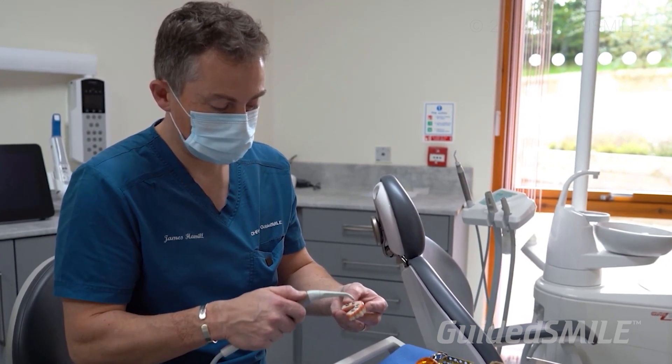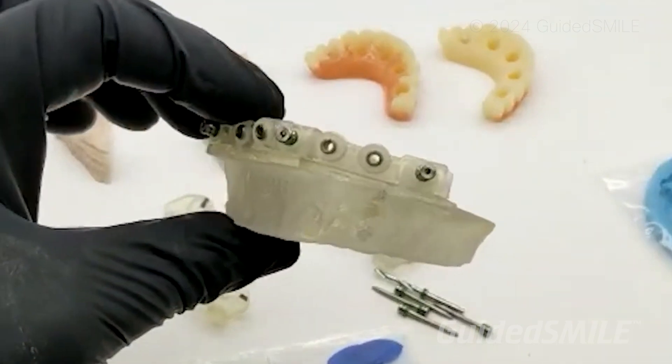You can even do a case in as few as four days if it's our Guided Smile Light. The first day is records, the second day is planning, the third day is fabrication, then go to surgery. It's the quickest thing on the market, the most affordable, and really probably the easiest to learn.